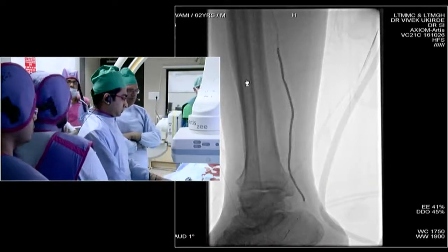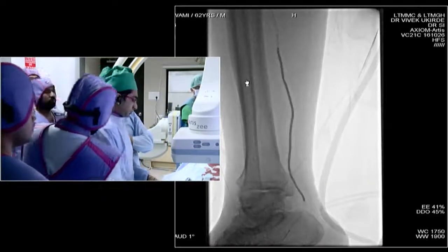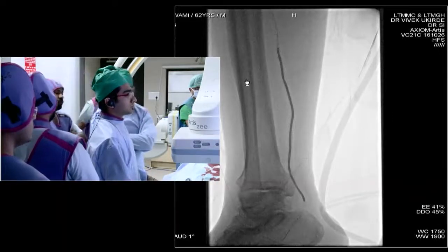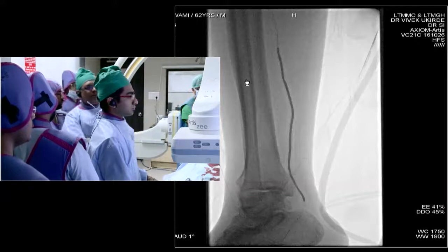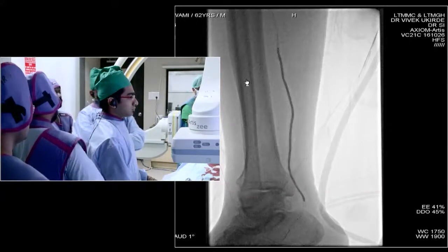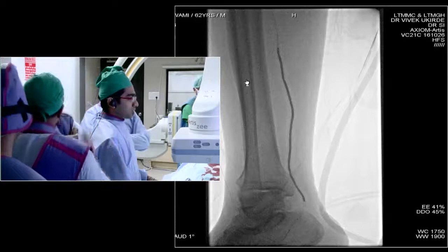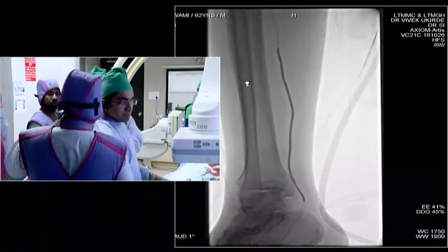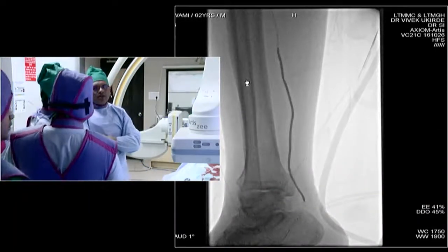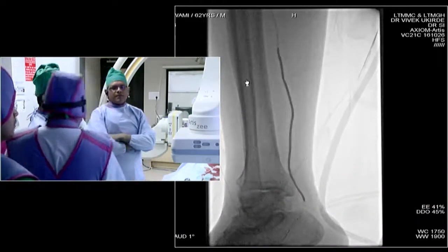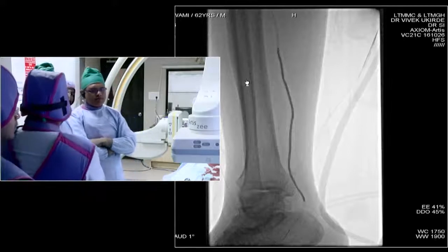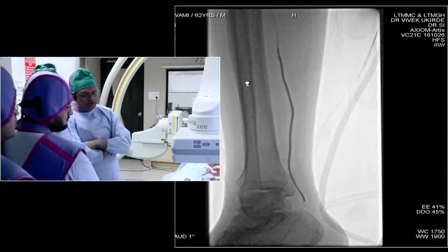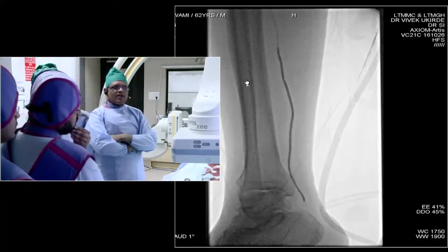How often have you seen vessel rupture in peripheral cases? I have never seen a vessel rupture — I am not worried about that. It's only the plaque which gets a little dissection, and then we prolong the procedure with further steps. In a small vessel, a small plaque causing distal flow obstruction again is the concern. My idea was to give just enough flow for the foot to heal.